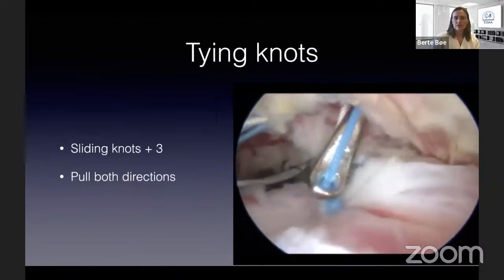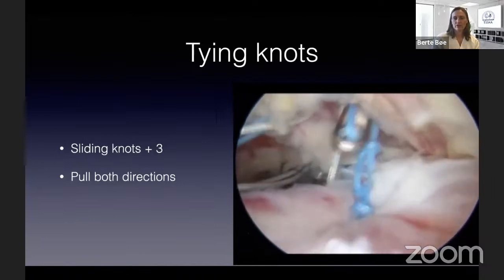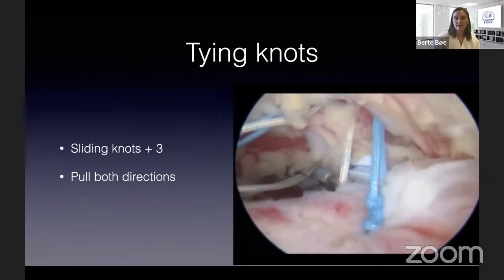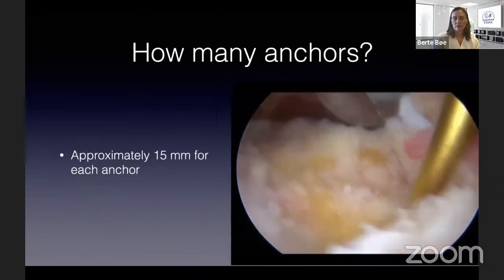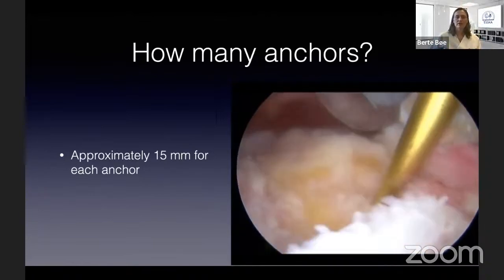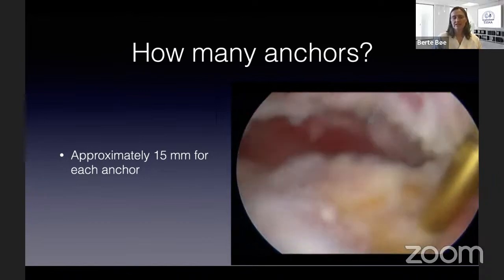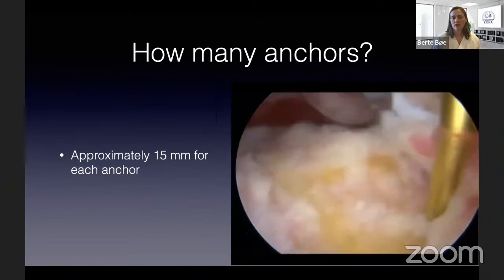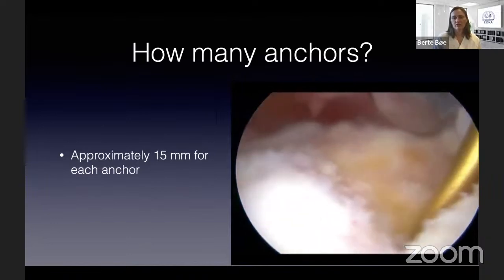So tying knots, of course, you have to pull in both directions to be sure that everything is tight. And when you're done with your first anchor, or when you start planning, of course, you have to think of how many anchors. My rule of thumb is that for every 15 millimeters, I need at least one new anchor for the first row, or if I do a single row repair.